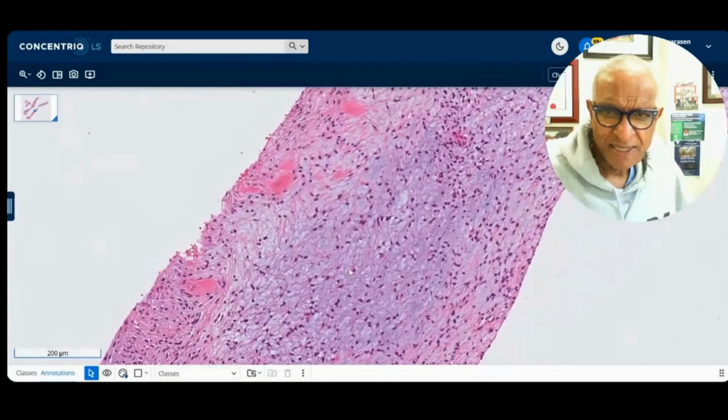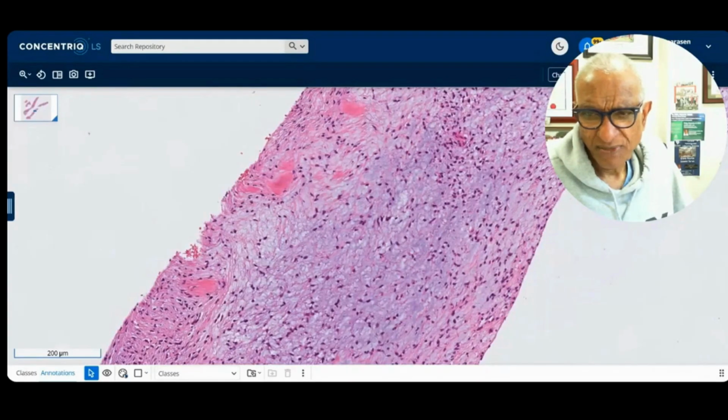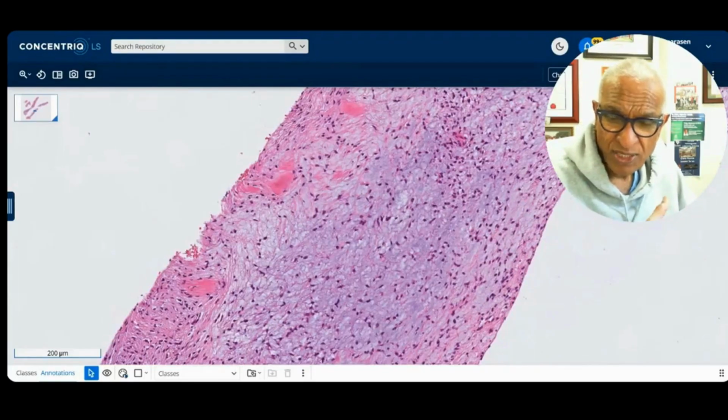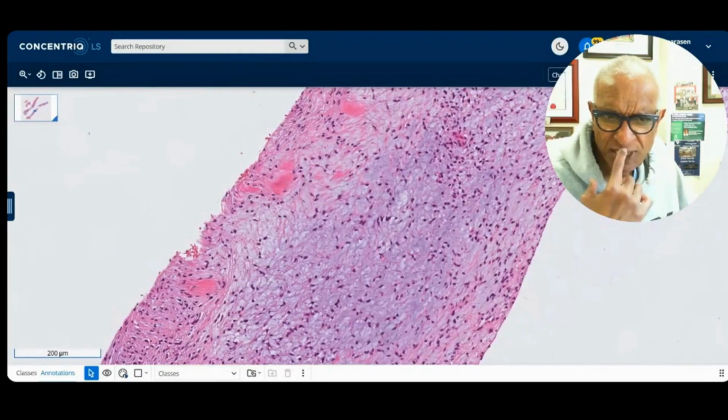For that, there are no immunomarkers, as you know. In the old days, when I was your age, they used to say that 20% of these were S100 positive, but they don't anymore. Nobody talks about that anymore. And people, to make that diagnosis, resort to FISH. Importantly, you do have to rule out the differential diagnosis, and the big differential diagnosis in this location would be a soft tissue myoepithelioma because of the myxoid and sclerosing areas. This is nice myxoid matrix because it has that gray-blue material in it as well.